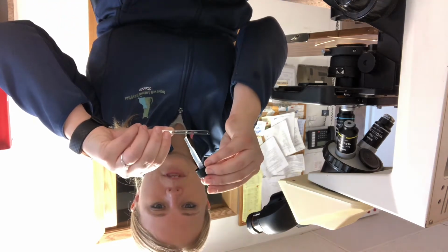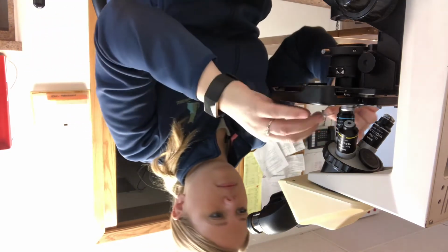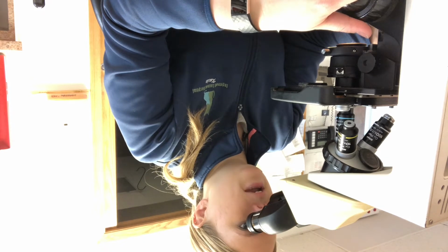And for that, I am looking for any possible parasites that could be in the ear that's causing this ear infection or the ear itchiness. And in this sample, you will get a lot of ear debris, even potentially some hair.